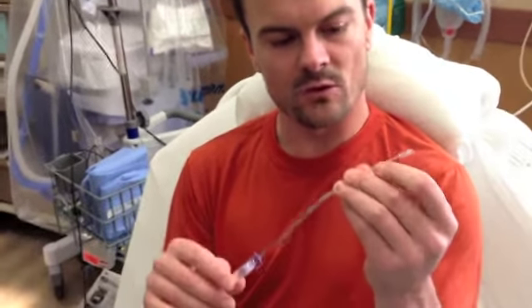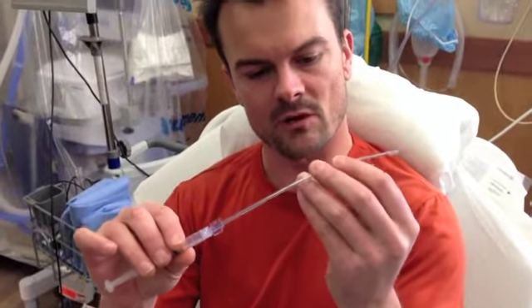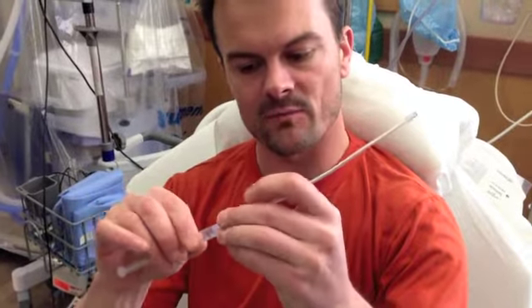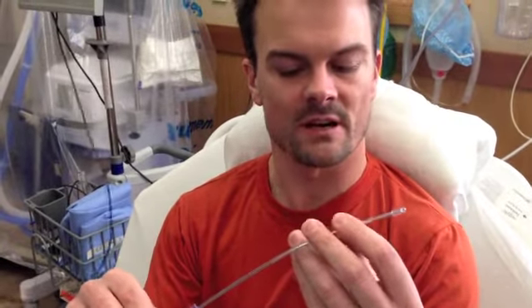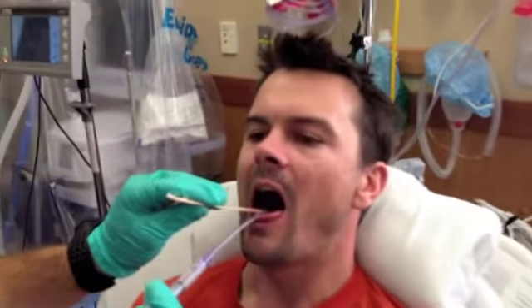The one thing we're going to do differently here is we're going to use this thing. This is one of the coolest devices ever. Like I said, this is that malleable stylet with the mucosal atomizing device, and Mike's going to squirt this on my posterior pharynx to assist with some anesthesia of my posterior pharynx, as opposed to my nasopharynx and oropharynx.